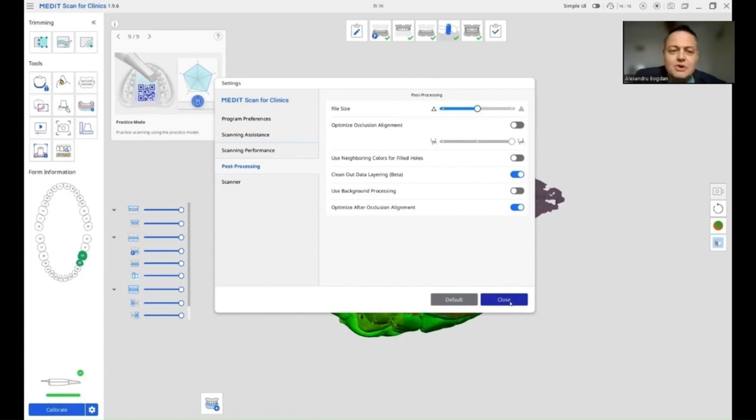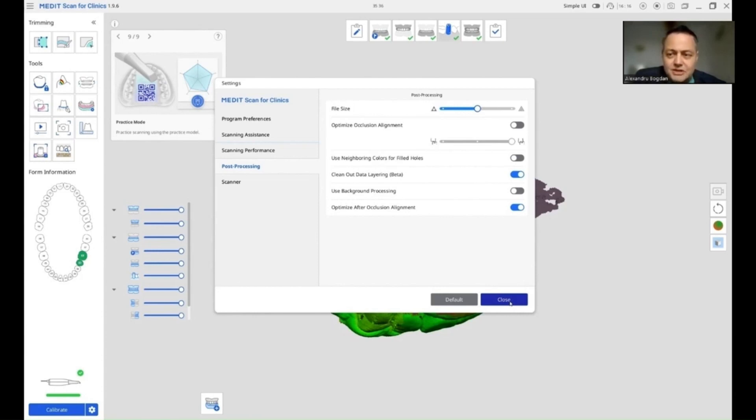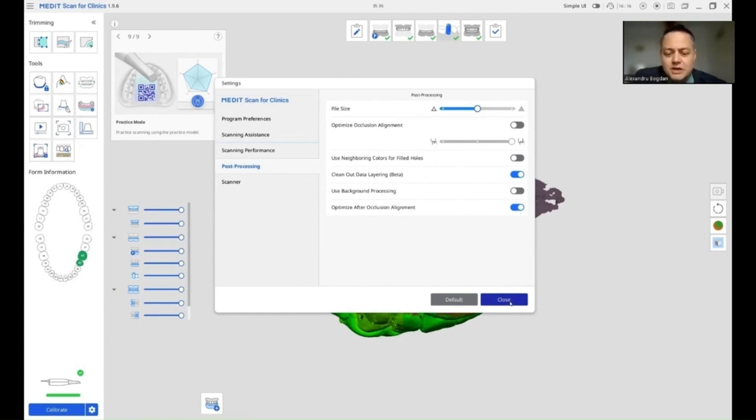Now, the technician will never know if you actually scanned that area and that area is correct or the software didn't. So if you uncheck use neighboring colors, the technician will see that the closed holes are grayed out. So that information is not actually done by you but by the software.